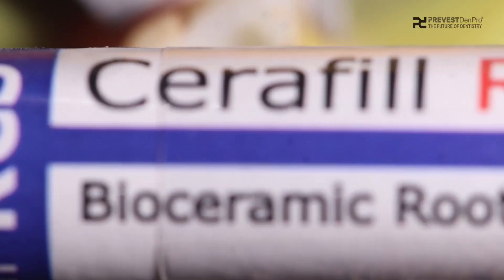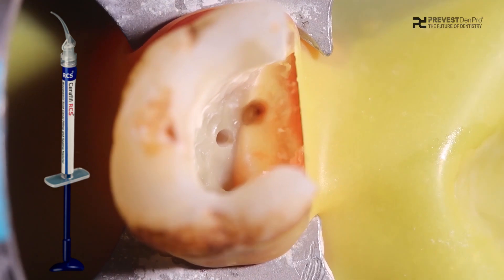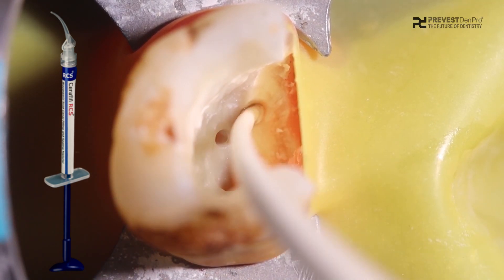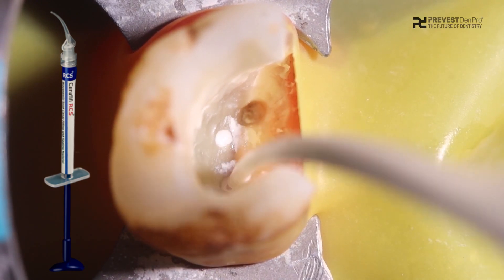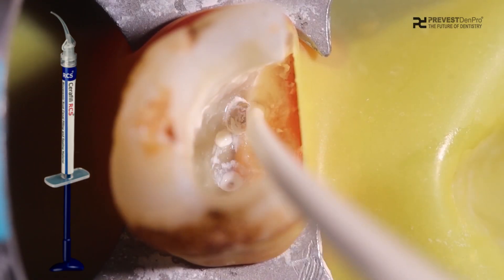Now, this Serafil RCS is a bioceramic root canal filling and sealing material. It can be used directly into the canal during obturation or in combination with GP points as a sealing material.